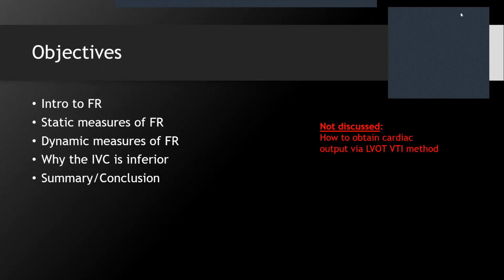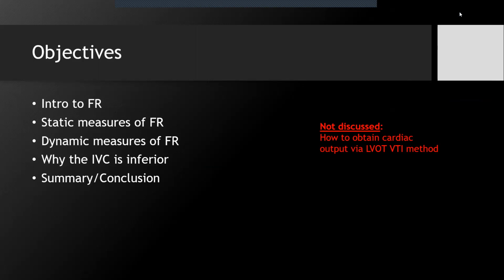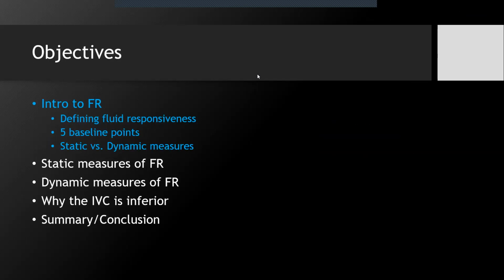One thing that we're not discussing today is how to get cardiac output via the LVOT-VTI method. That's important for assessing fluid responsiveness, but we've discussed that in a previous lecture. So if you need to review that, I'll make that link available to you. Just let me know.